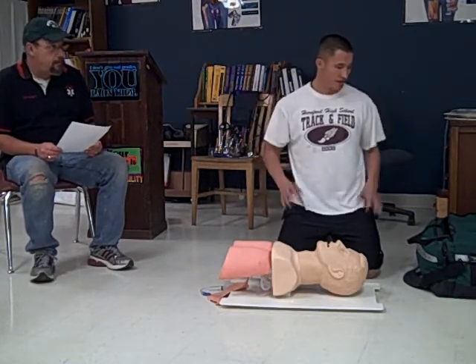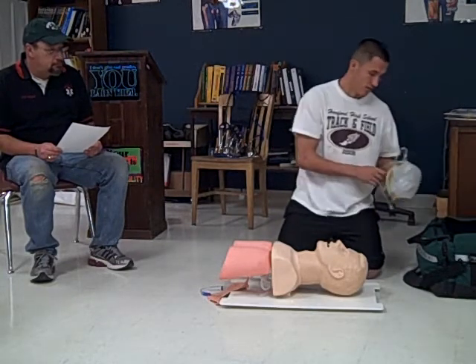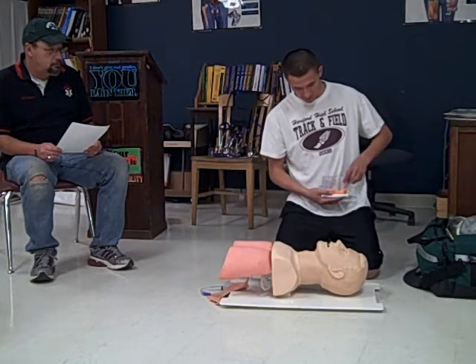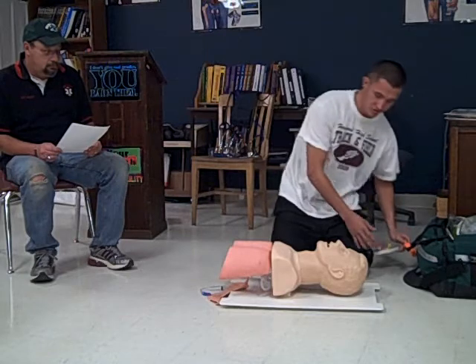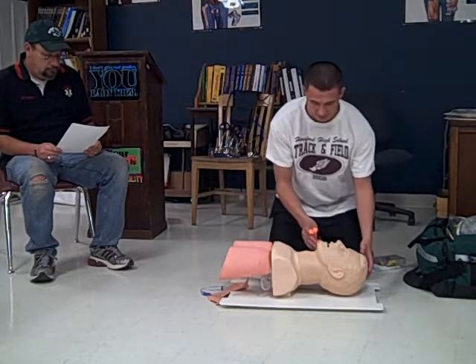BSI for my buddy and I. Scene is safe. I will begin by applying an OPA. I'm going to measure it from the corner of the ear to the corner of the mouth to create a proper fit.